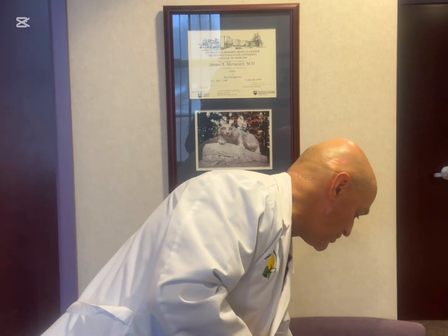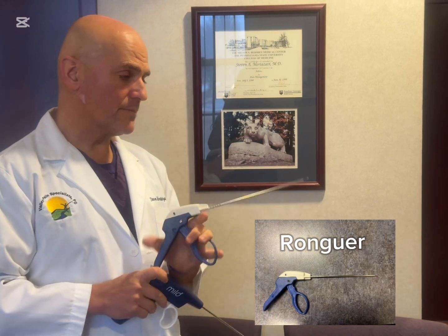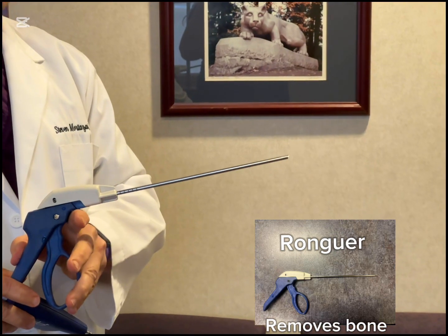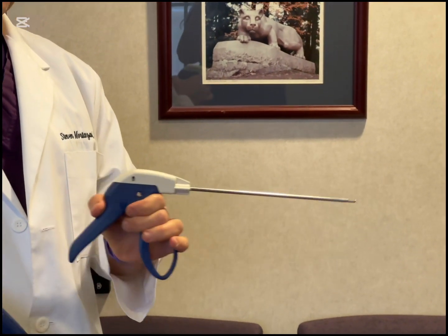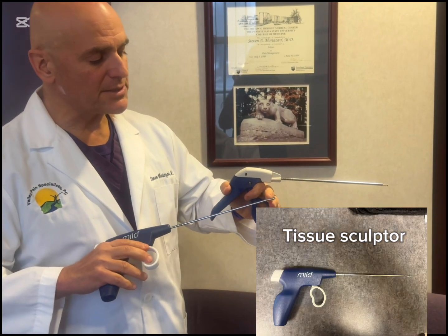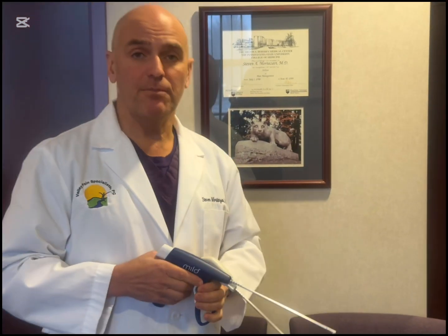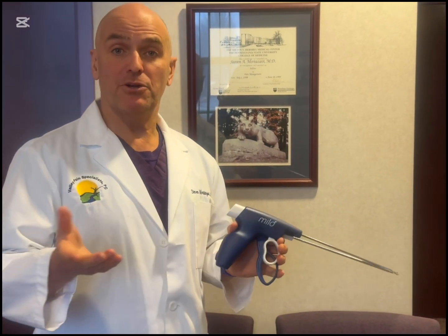So we're going to place these instruments — this is called a rongeur — and punch out bone tissue and remove that. Then this instrument here, it's called a tissue sculptor, and this can punch out some of that ligament. It's basically almost like a minimally invasive neurosurgical procedure, but again performed as an outpatient, takes about 15-20 minutes, and no sedation is needed — it's all done under local anesthesia.